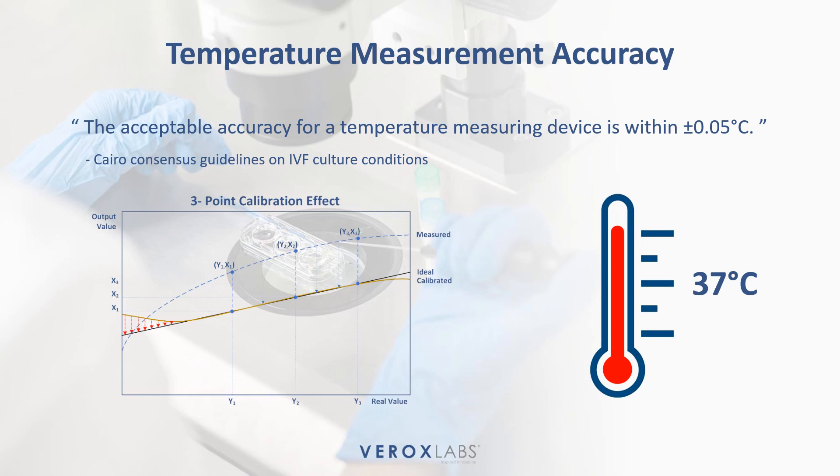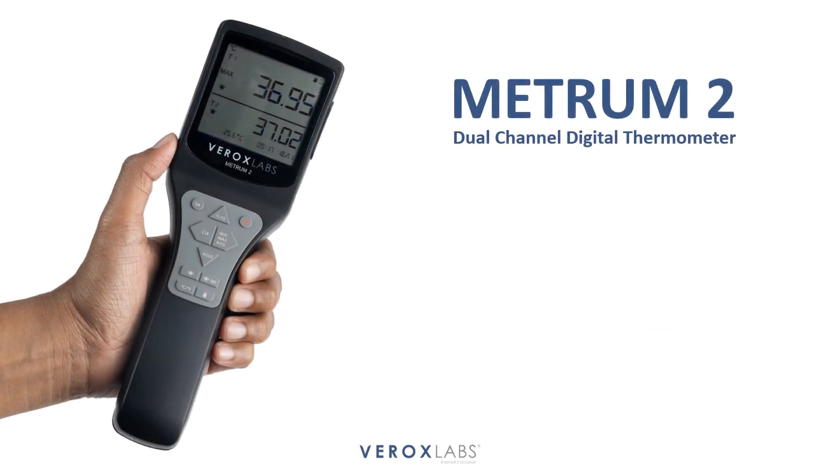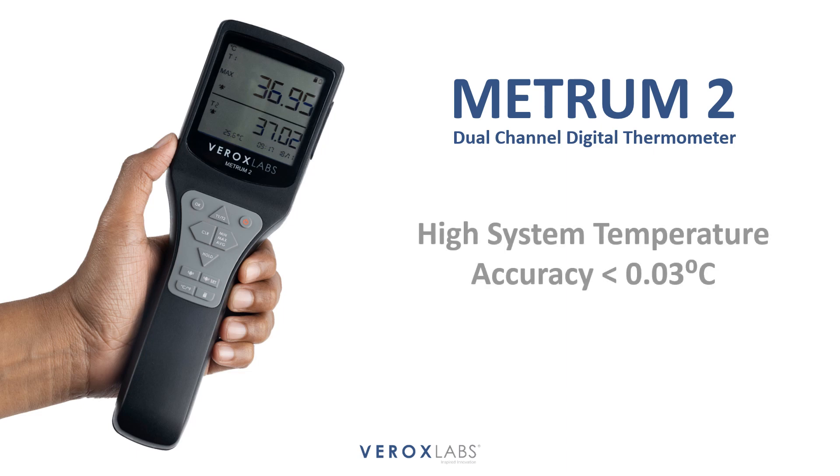Raise your quality control operations with the powerful METRUM2 dual-channel digital thermometer, offering high system temperature accuracy of 0.03 degrees Celsius.